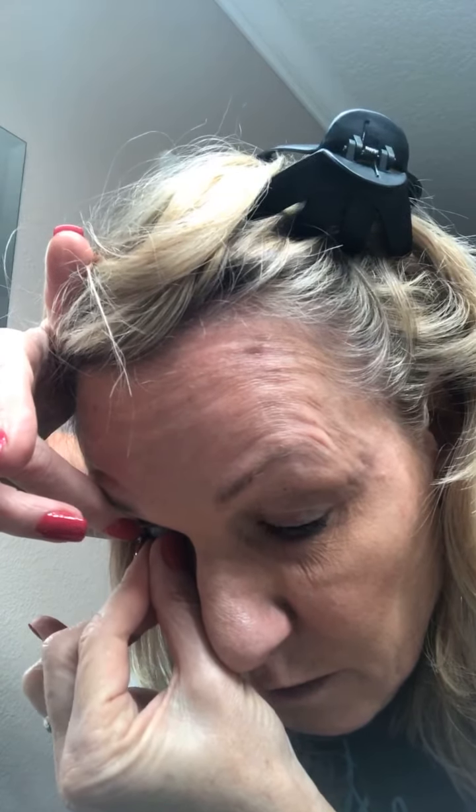All right, let's see if I can do the second one that well. I should not talk and do this. Wow, I'm not kidding you — I was at least two hours in the doctor's office last night trying to get them out. He gave me a different way to do it, but definitely this way that my sister told me is the better way to do it.